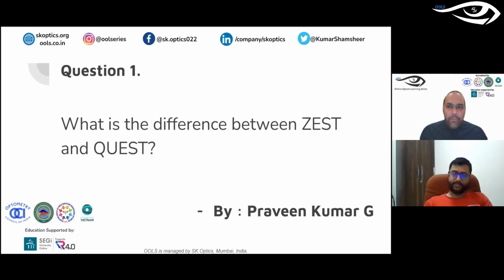Well, it's pretty similar. Let me pictorially explain how ZEST works. In ZEST, you take a prior probability mass function and calculate the mean of the prior probability mass function, and the mean is shown as the stimulus, and then you get the response.